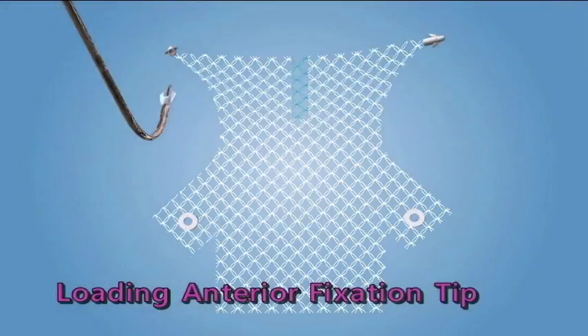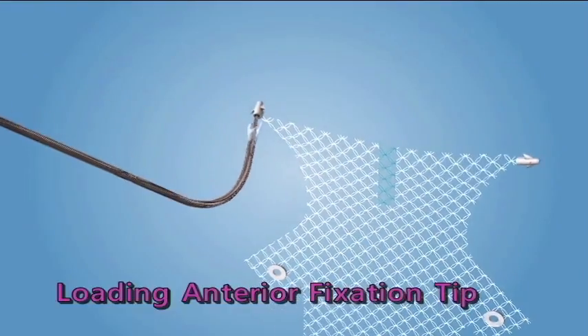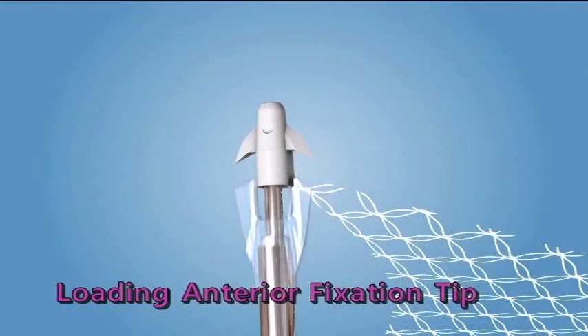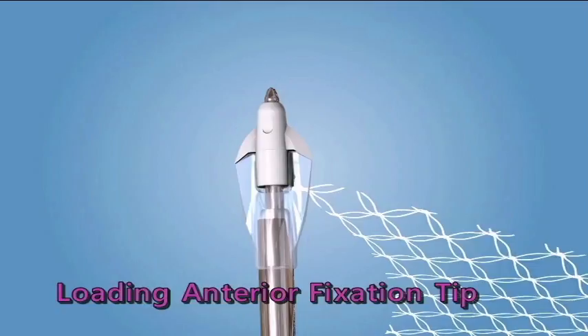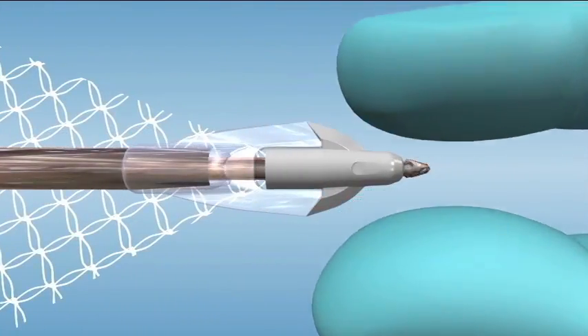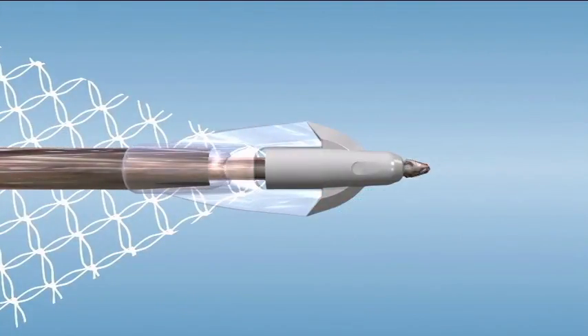Loading the Anterior Fixation Tips. When loading the anterior fixation tip onto the anterior needle, a snap should be felt indicating that the tip is fully engaged, which prevents rotation or disengagement during placement. Visualize the needle tip protruding through the distal end of the anterior fixation tip.